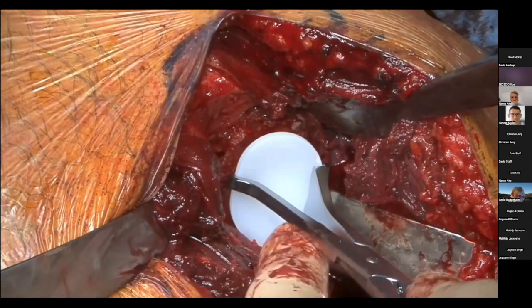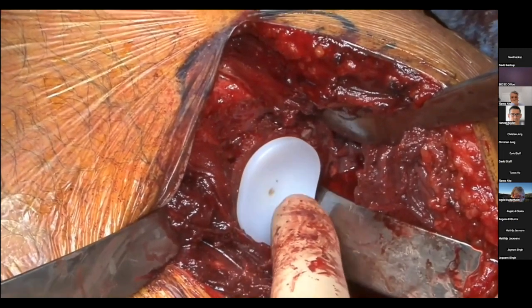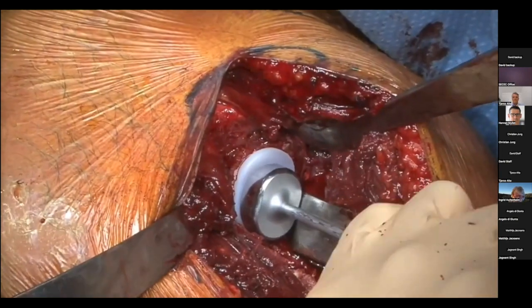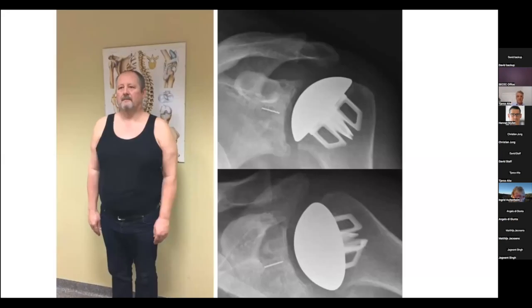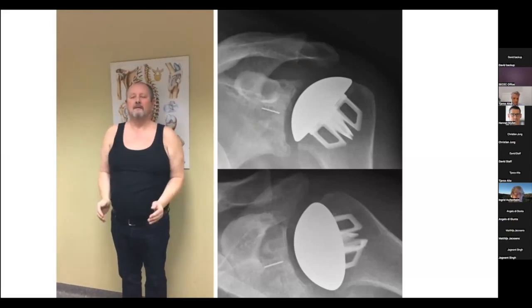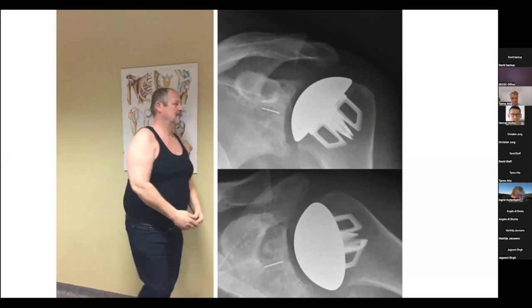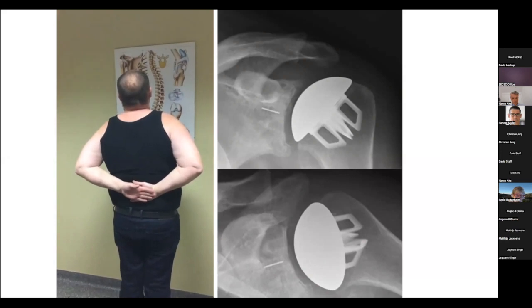that he preoperatively measured. And this is much more accurate, of course, than just standard instrumentation, where the surgeon needs to eyeball his correction. This is that same patient 1 year later with an excellent result in an anatomical situation where the deformity was corrected to something that was more acceptable, but still without compromising the bone stock.